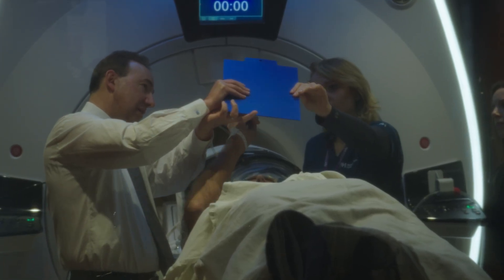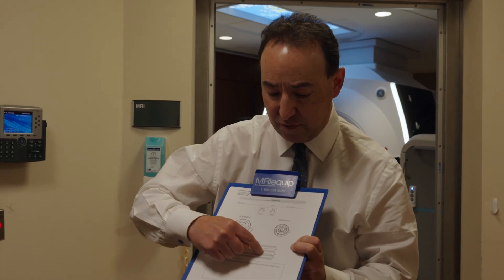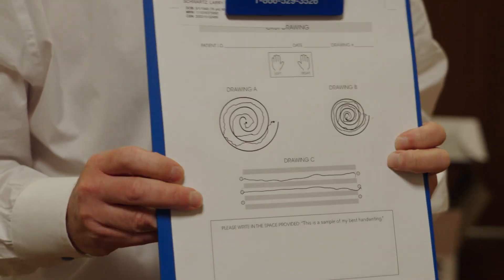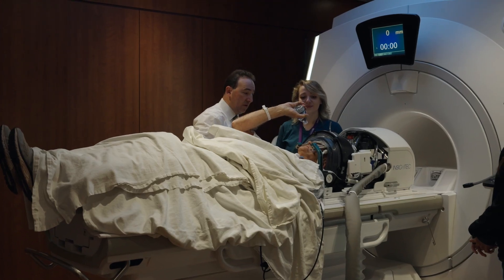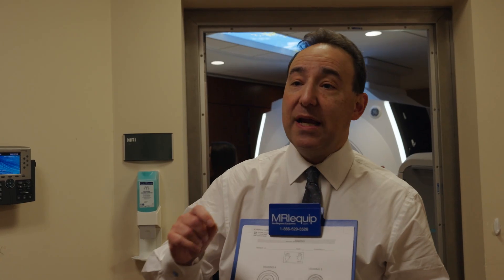After our first permanent lesion, his tremor looks much better than when we started. He can now draw a relatively straight line and stay in the lines on the spirals. The idea is not to take away all of the tremor — the more we push, the more chance we have of causing side effects. We want to get rid of most of the tremor to make his hand more functional and improve his quality of life, but not necessarily 100% of the tremor.